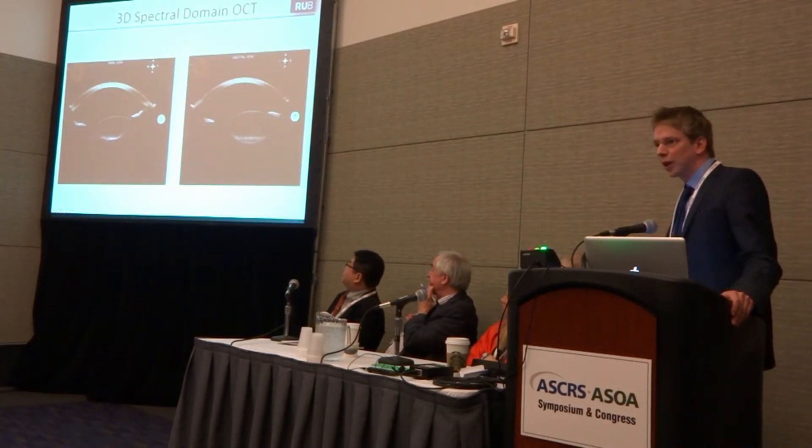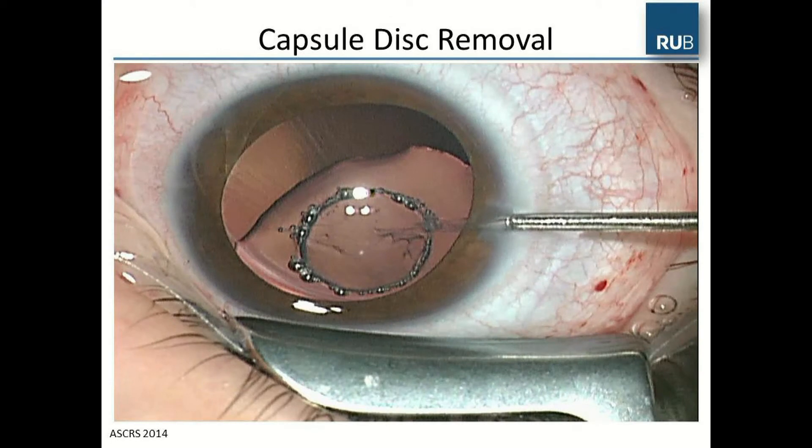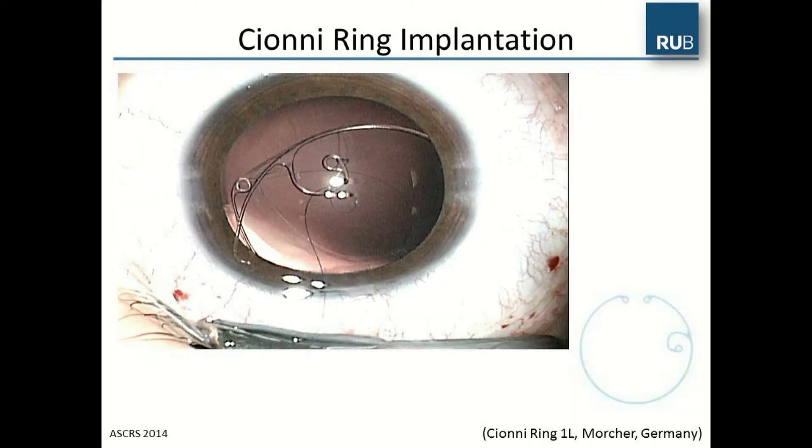In the 3D spectral domain OCT, you can see that the lens was decentered temporally in the axial view and superiorly in the sagittal view. We then performed the treatment, removed the capsule with forceps, and used irrigation-aspiration to remove the lens. In the next step, the capsule tension ring from Morcher, Germany was implanted.